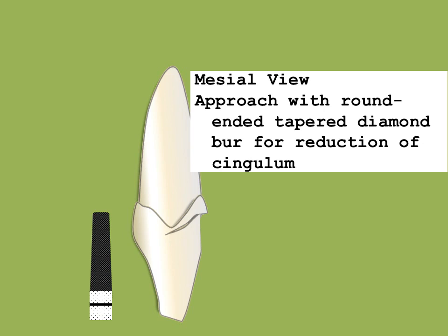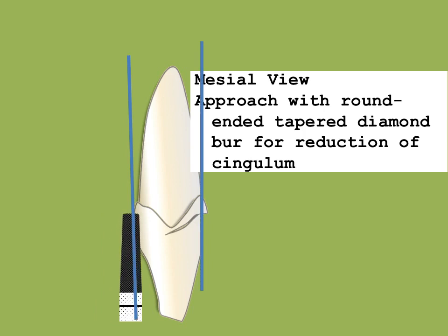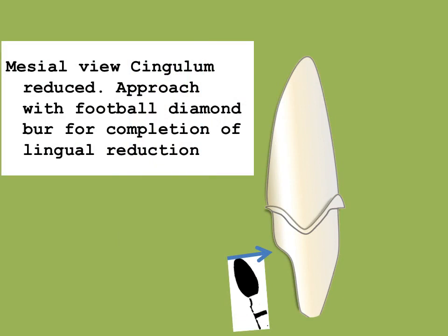Reduction of the lingual occurs in two phases. First, cingulum wall reduction, where the burr is held parallel to the long axis of the tooth and the 6847-type burr is used. One may use depth cuts, but sufficient clearance must be produced to have a one millimeter thick restoration in all excursions. The burr should produce the correct taper to oppose the labial wall taper. This is a critical component of resistance and retention. The one millimeter shoulder is extended into the proximal surfaces and completely circumscribes the tooth. The second phase of lingual reduction is the preparation of the lingual fossa area, done with a football-shaped diamond, the Brasseler 6368-type burr. Depth grooves may be placed with a round burr to assist in the correct reduction. All line angles should be rounded.